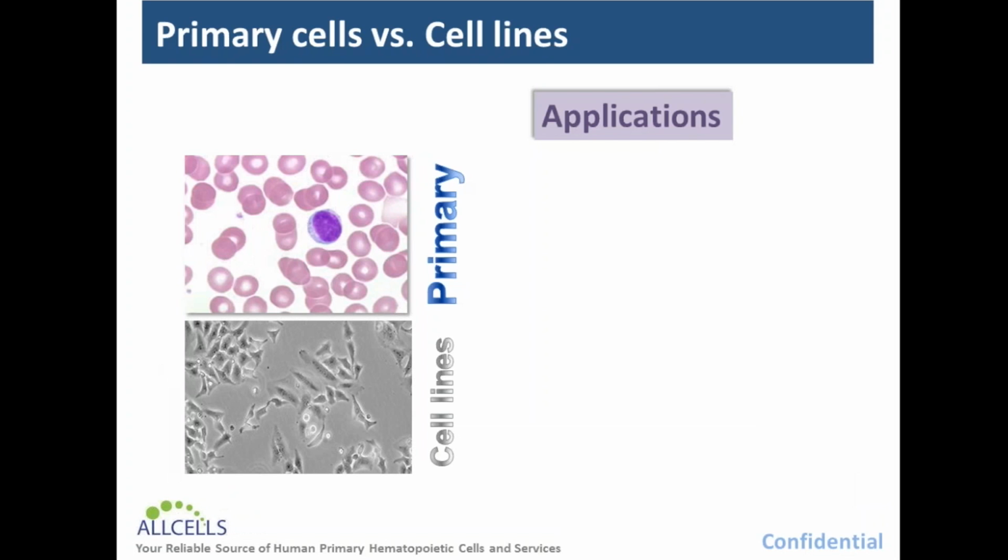All of this is not to say that cell lines do not have a role in biological research. Cell lines such as HeLa have clearly demonstrated their historical importance, serving as a first-generation cell culture model, contributing to major historical, biomedical, and engineering breakthroughs, such as vaccines, recombinant DNA, and protein production. Due to their growth characteristics, they have been critical in elucidating the mechanisms of self-renewal, cellular transformation, and even oncogenesis.